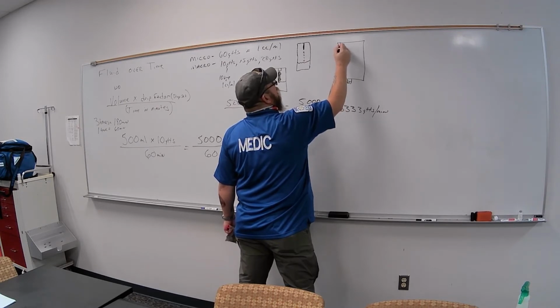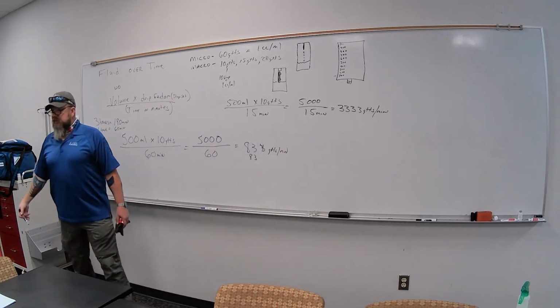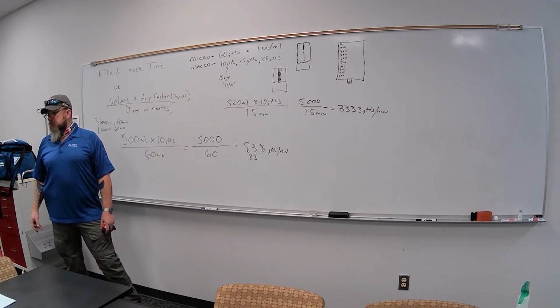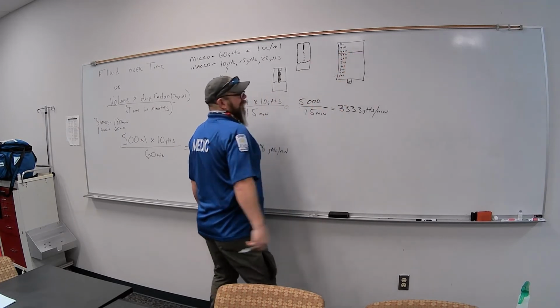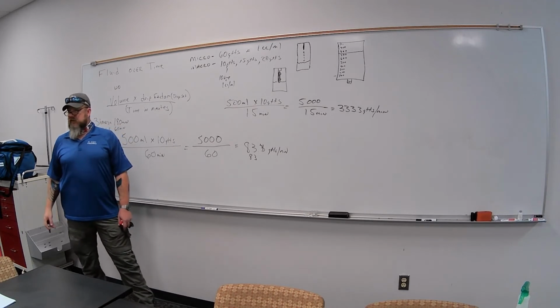They might have one figure up at the top. Okay? Then sometimes we just have to watch and say, okay, we're gonna give a 250 ml bolus, right? We got our line started. And when the bag gets right there, we're gonna reevaluate. Does that make sense?